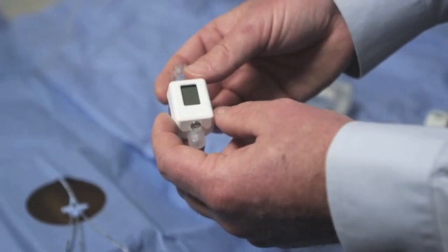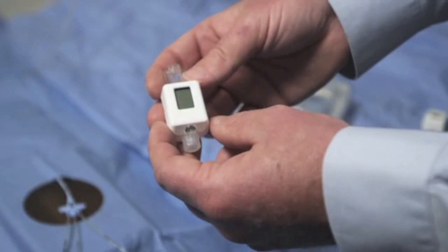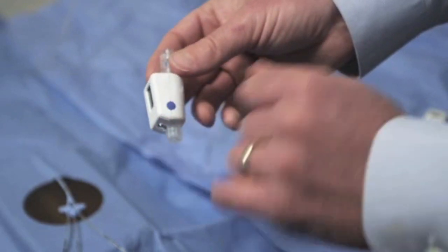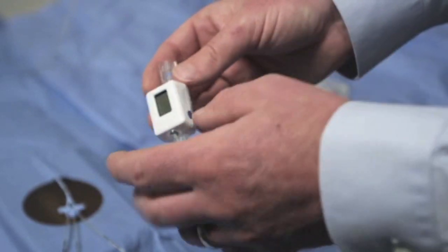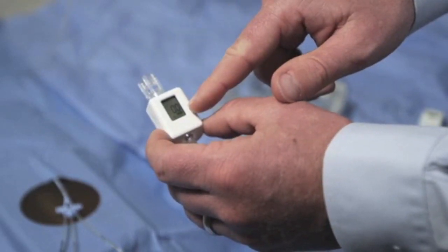The device comes sterile in a single-use pouch. Once the pouch is opened, the device is turned on, activated, and calibrated by depressing the blue button on the side. It's important to press the button until 00 is displayed on the screen.